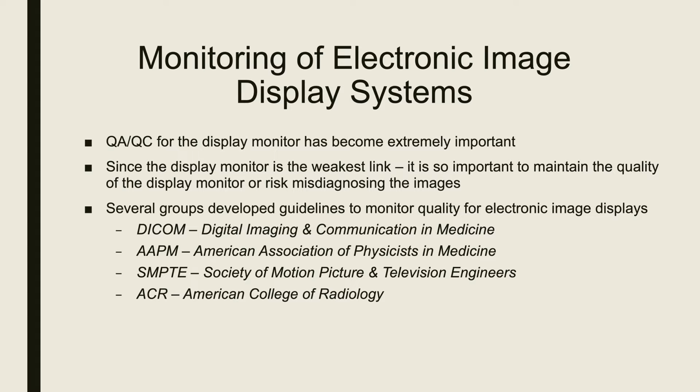As you can see, there are several groups that have developed guidelines to monitor the quality of electronic images. DICOM, remember, is Digital Imaging and Communication in Medicine. They have standards that they've developed, guidelines. The American Association of Physicists in Medicine has also established guidelines, and that's the group we follow, because physicists check all of our equipment. There's also the Society of Motion Picture and Television Engineers, and then the American College of Radiology.